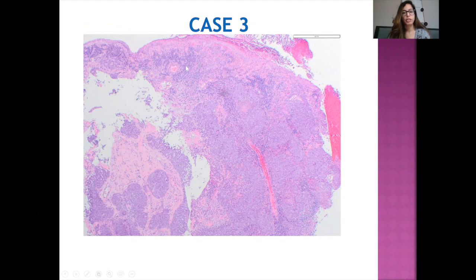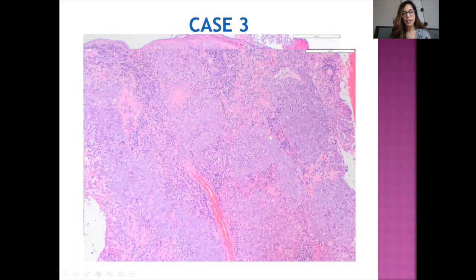It's quite a good chunk, excisional biopsy. And again, we identified that there seems to be a vague clustering or a vague cohesiveness to some of these small round blue cells that again look like they're a different shade of blue compared to the lymphocytes. On higher power, it can actually be very difficult to pick up sometimes these lesions, especially when it's a very small biopsy or a very limited tumor.